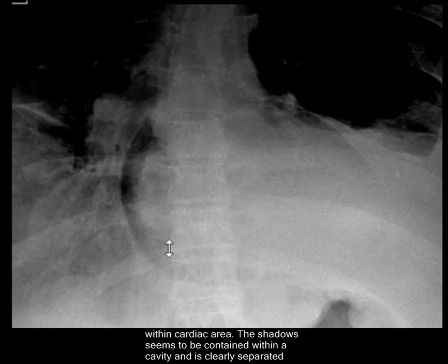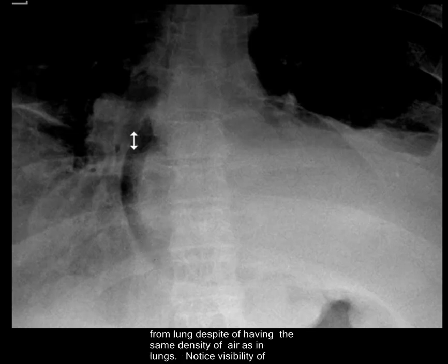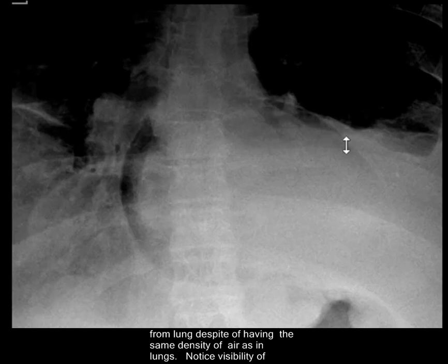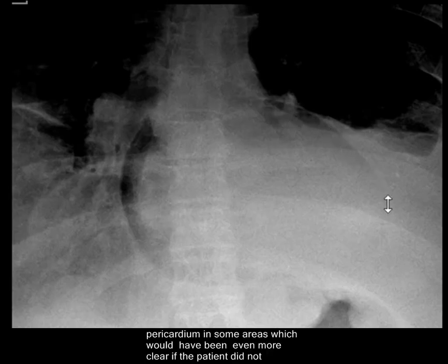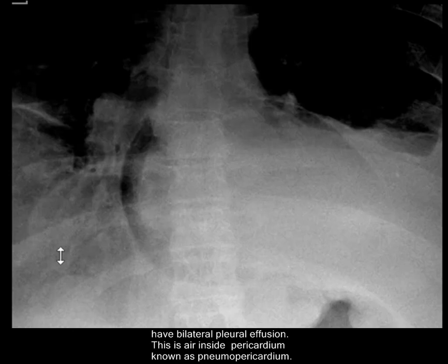The shadow seems to be contained within a cavity and is clearly separated from the lung, despite having the same density of air as in the lung. Notice the visibility of the pericardium in some areas, which would have been even more clear if the patient did not have bilateral pleural effusions.